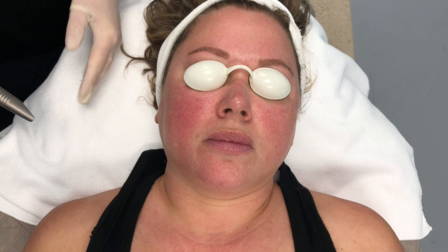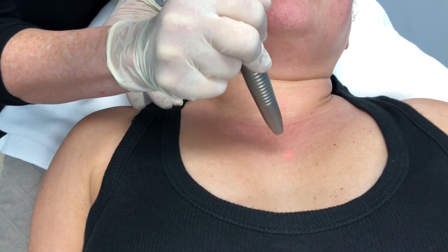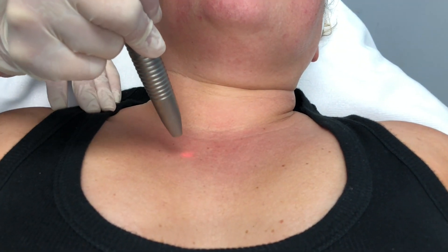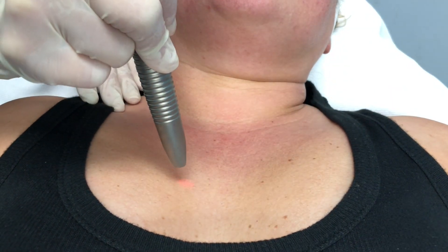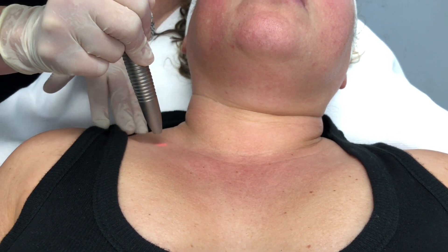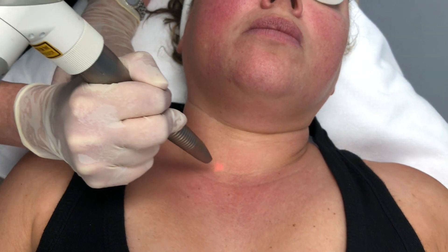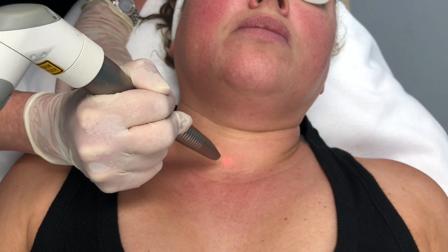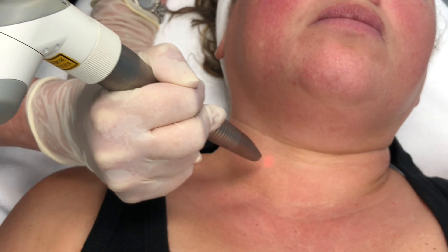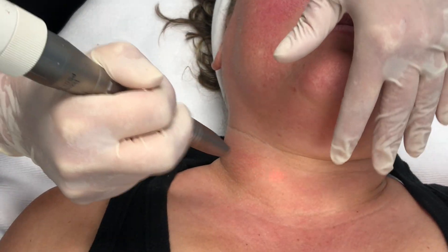The light laser peel in the summer — I only do it about five microns. It's just a nice freshening for the skin; it gets off those top layers of dead skin cells so that their products will sink in better. They might have some microfine flaking in a couple of days. People with thicker, oilier skin may not have any flaking at all, but it really helps the skin to be more hydrated with a healthier glow and no downtime. They will look great when they get up off your table — you can put some good serums on them, add sunscreen, and they can put makeup on immediately and go out to dinner looking great.